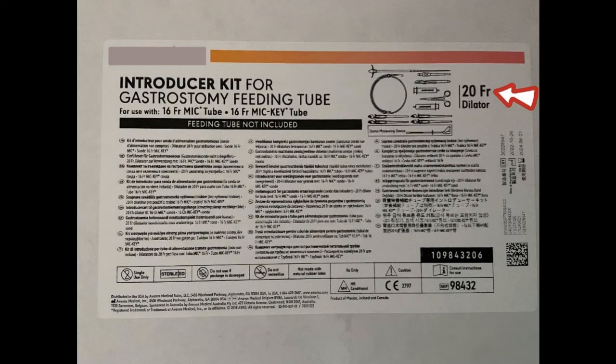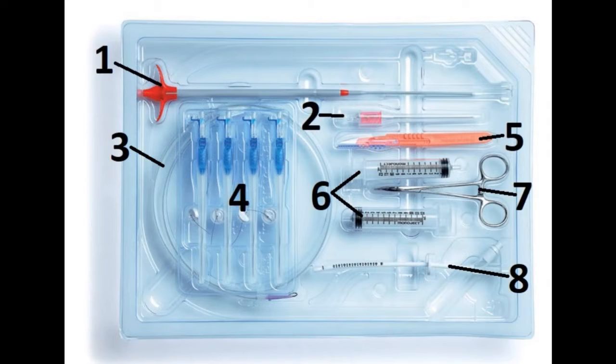We have the introducer kit that is used for insertion of the feeding tube. A 20 French introducer kit is compatible with a 16 French tube. These are the contents inside the introducer kit.